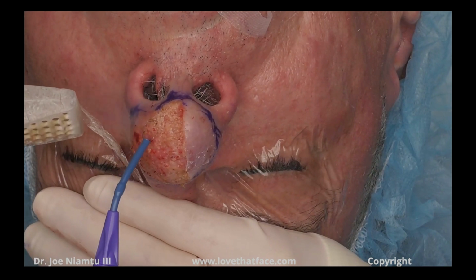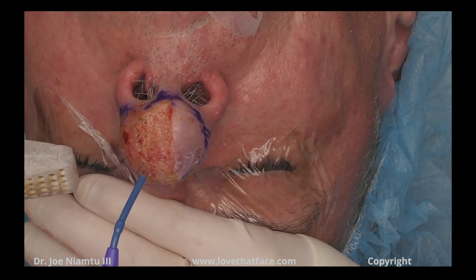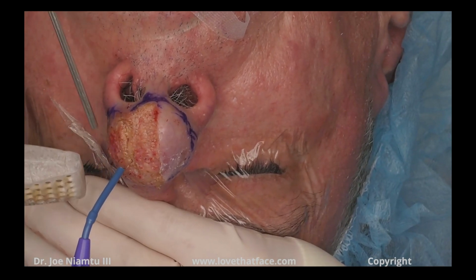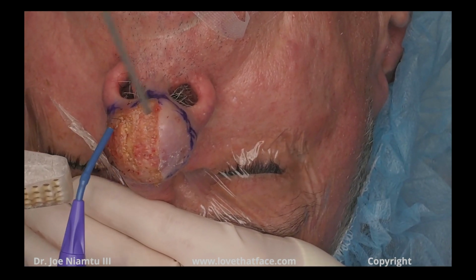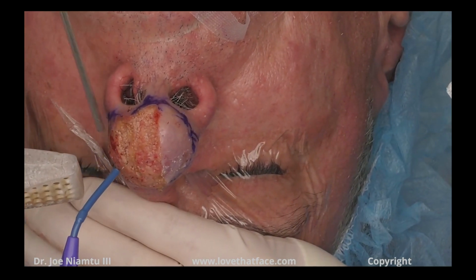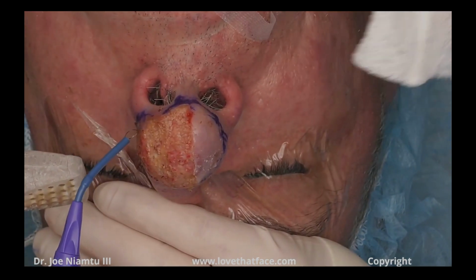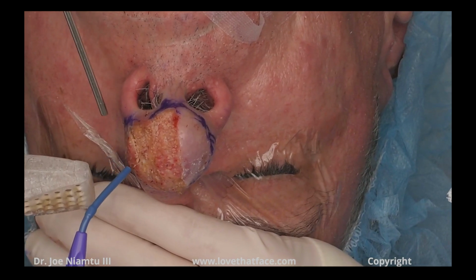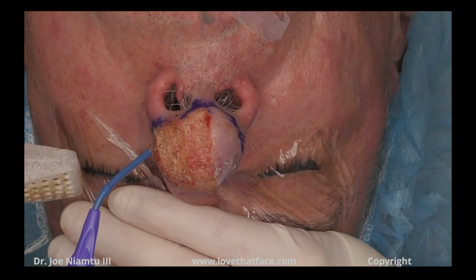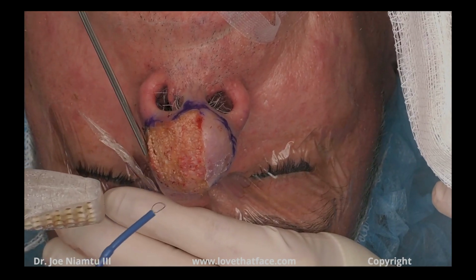This is the Soniquence radio wave system. I'm using this at a setting of about 30. And I am just shaving off these hypertrophic areas of sebaceous glands and sebaceous tissue and fibrous tissue. And you can see the pockets of sebum and sometimes purulence in these Rhinophyma patients.